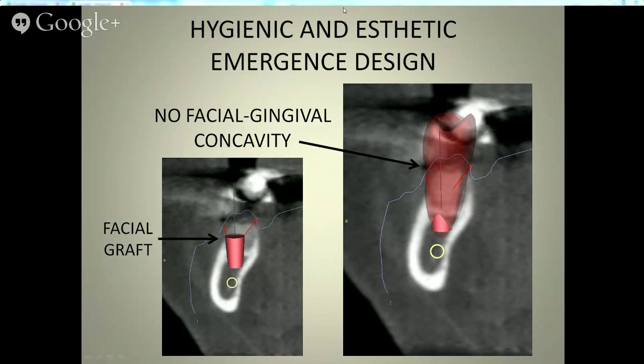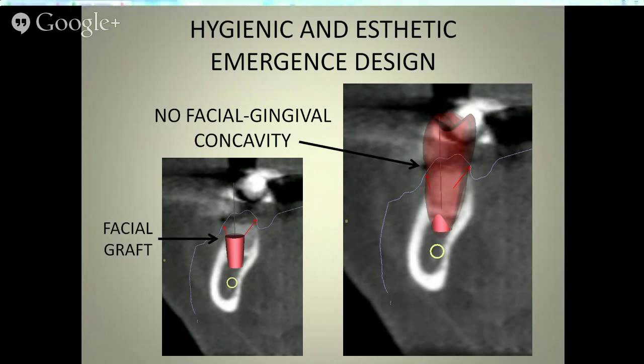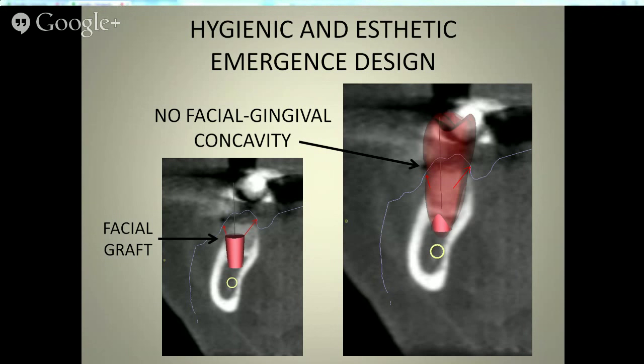Okay, there's a question that came in asking who's marking the nerve canal? Can we incorporate radiologist reports into the software? I'm sorry, I didn't catch the last part of that. If radiology reports can be incorporated into the software. Well, radiology reports are available. I don't think you can.